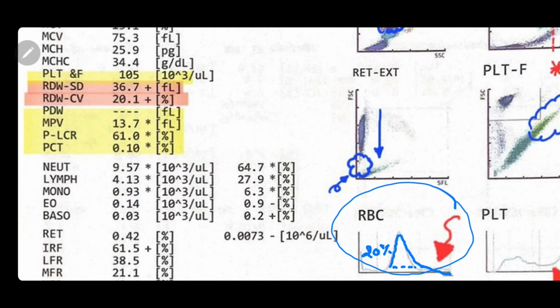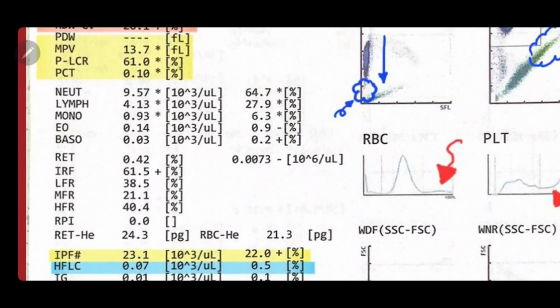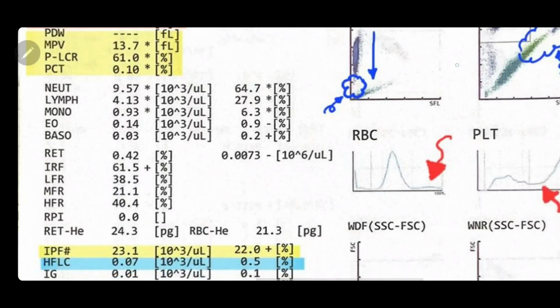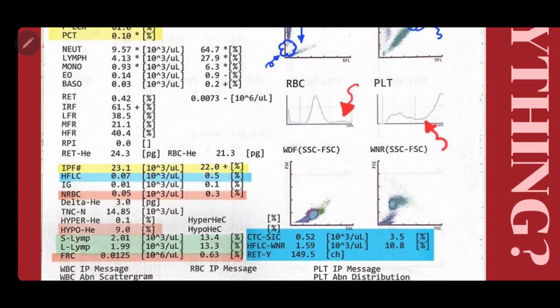Now, let's look at the platelets. The platelet count has decreased to only 100,000. When the platelet count decreases, the first responding value is the IPF. Let's take a look at it. Let's continue with some new values.